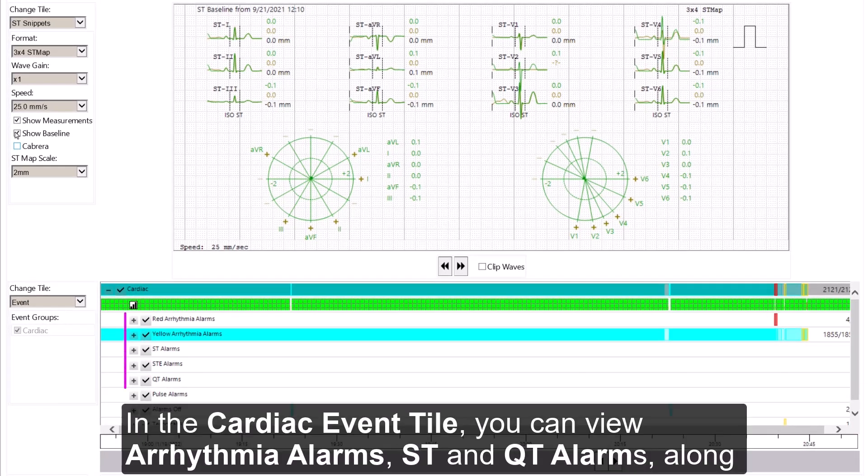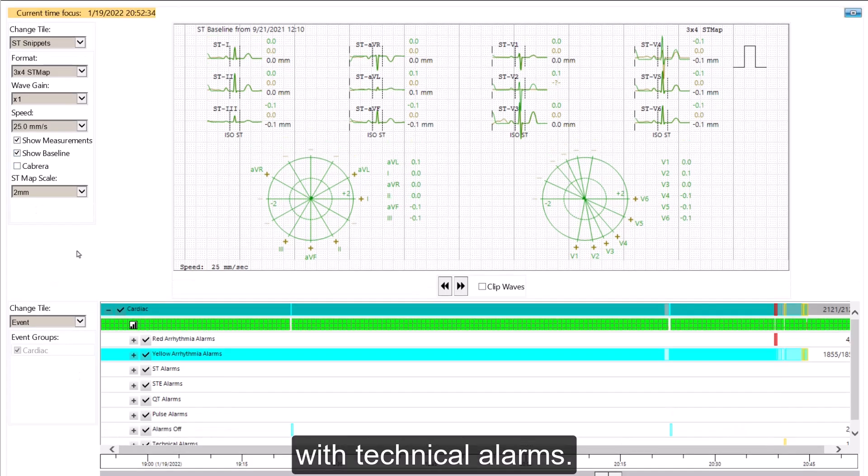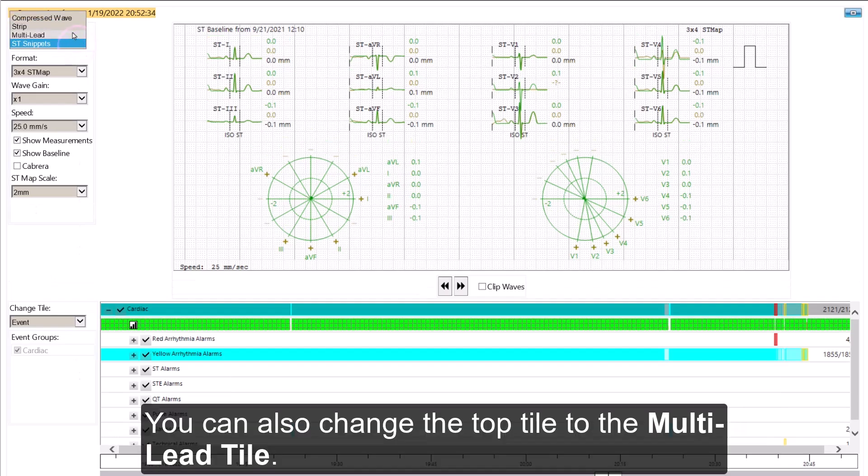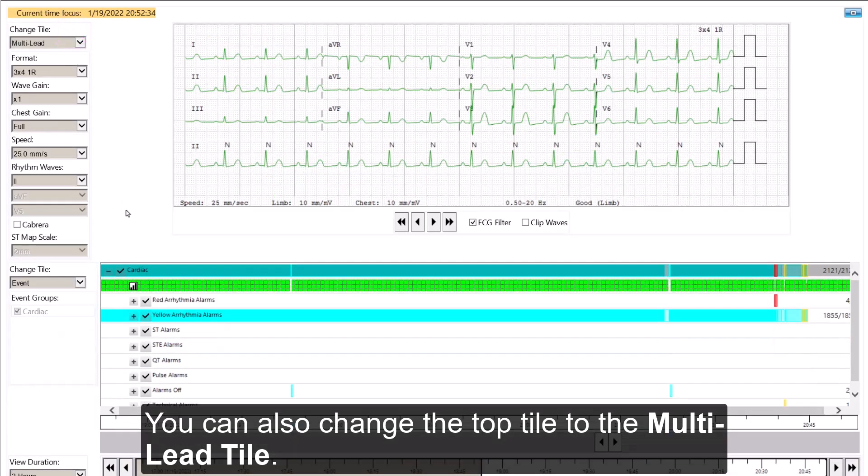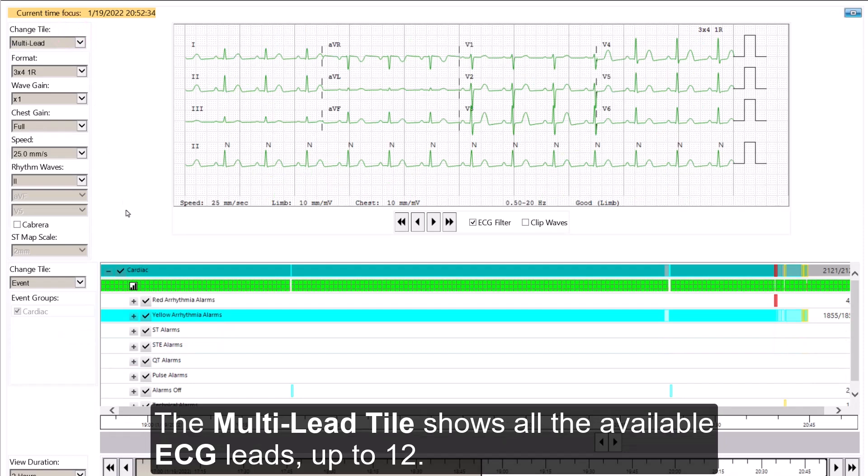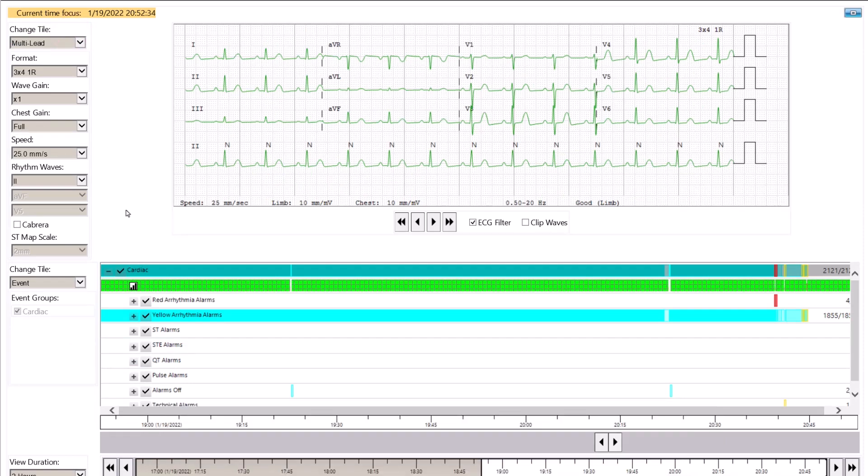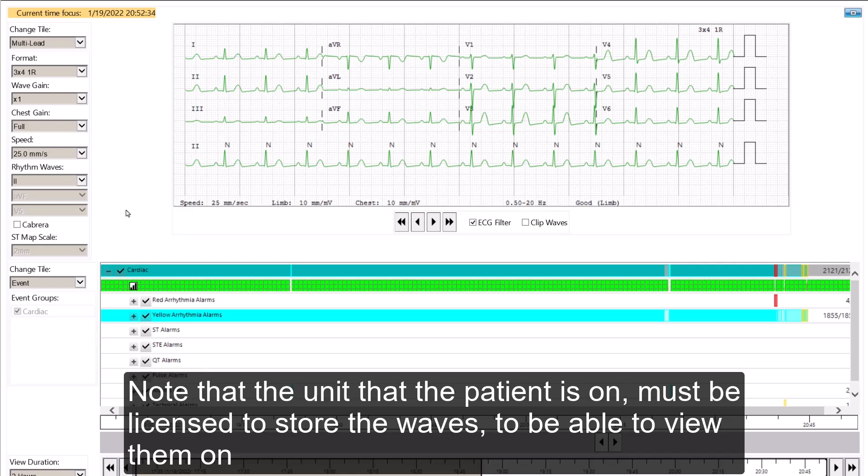In the Cardiac Event tile, you can view arrhythmia alarms, ST and QT alarms, along with technical alarms. You can also change the top tile to the Multi Lead tile. The Multi Lead tile shows all the available ECG leads up to 12. Note that the unit that the patient is on must be licensed to store the waves to be able to view them on the web.